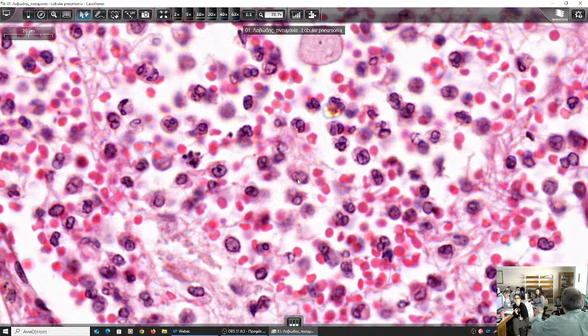Which is the prerequisite for the lysis of inflammation? No architectural destructuring of the tissue. Because if we have architectural destructuring of the tissue, then it won't be possible for the inflammation to be lysed. It will have healing. The healing process will start, and we'll see that. Any questions here? Yes? This is going to lead to metaplasia and dysplasia? No, not necessarily. No, it's rather irrelevant.